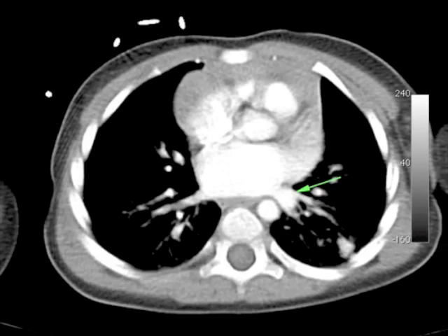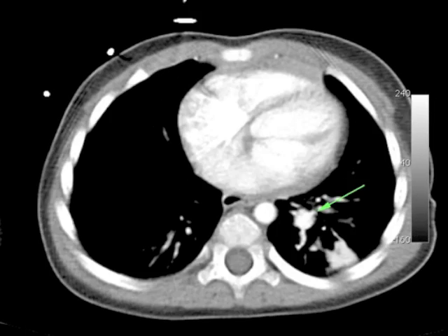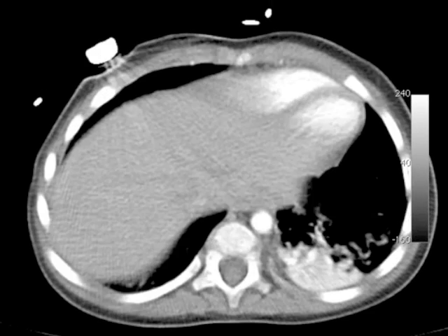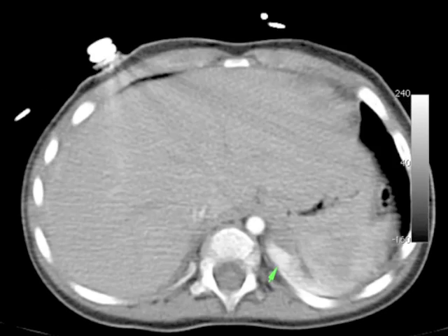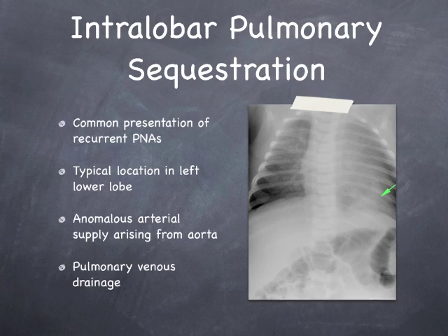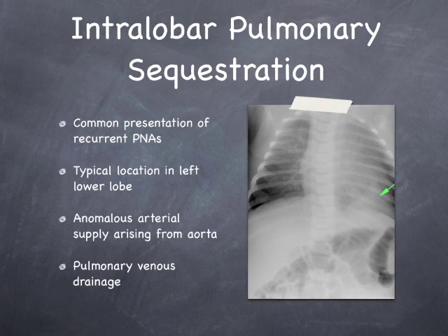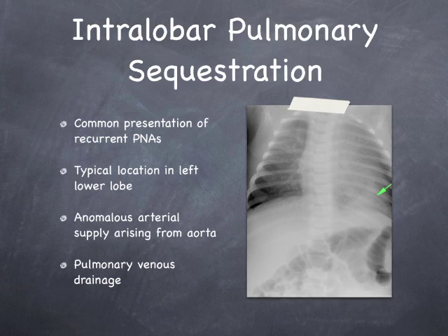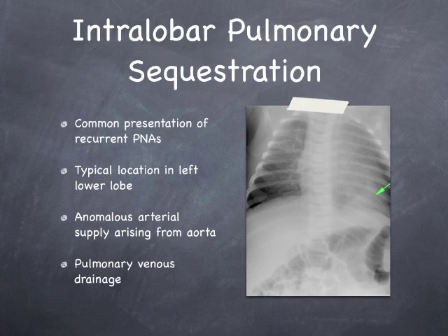On the axial series, we can also see that this segment drains into the left pulmonary vein, allowing us to make a diagnosis of intralobar pulmonary sequestration in this child who presented with recurrent pneumonias.